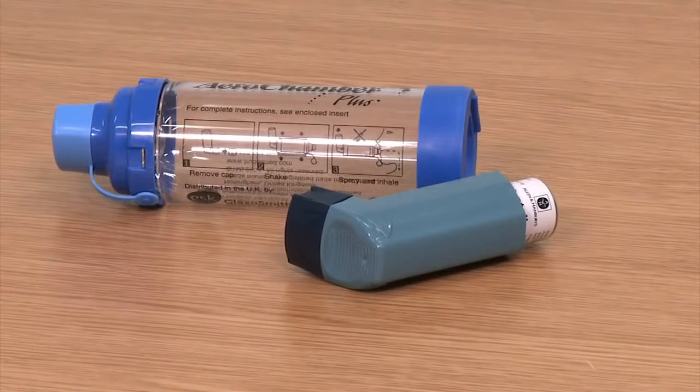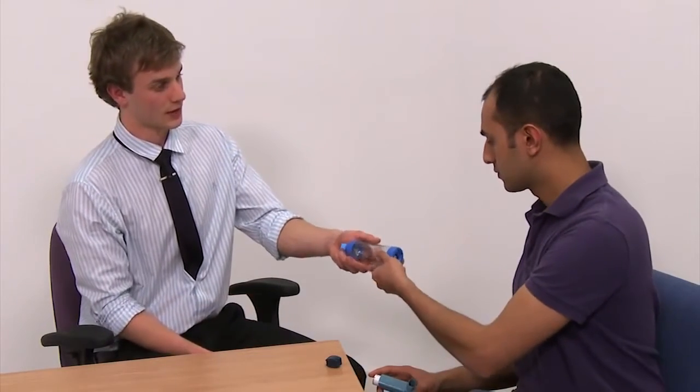Spacers, such as this aero chamber, reduce the need for coordination by holding the aerosolized medication within a chamber. They may be used with either a single breath or multiple breath technique. Okay, so now I'm going to explain how to use your aero chamber. And so this is very similar to what we just did.